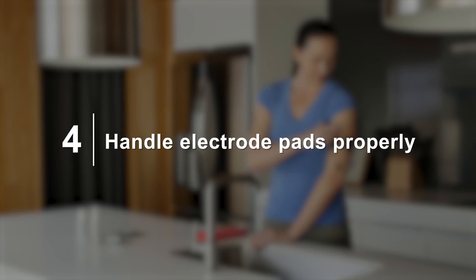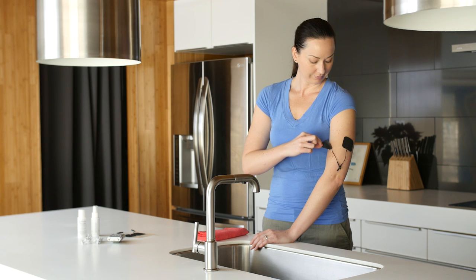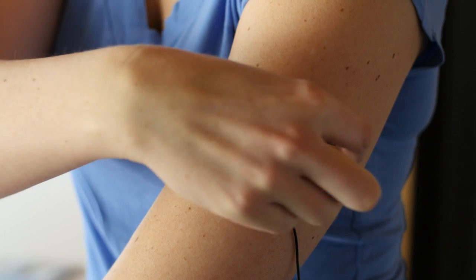Four: ensure proper handling of electrode pads. Remove electrodes by lifting the edge of the electrode pads. Do not pull on the wire.